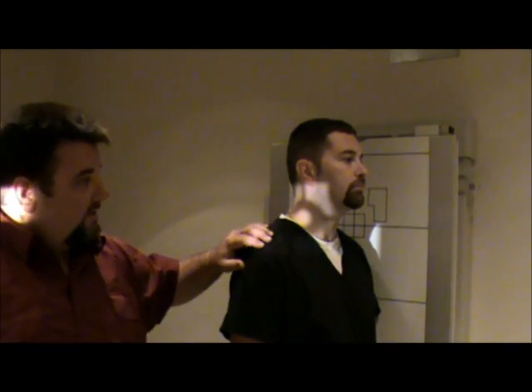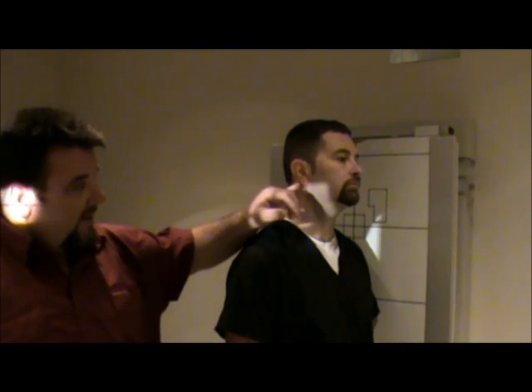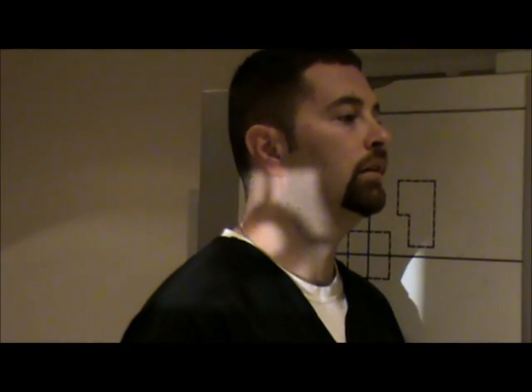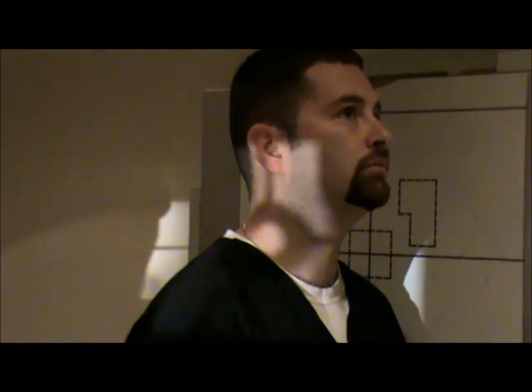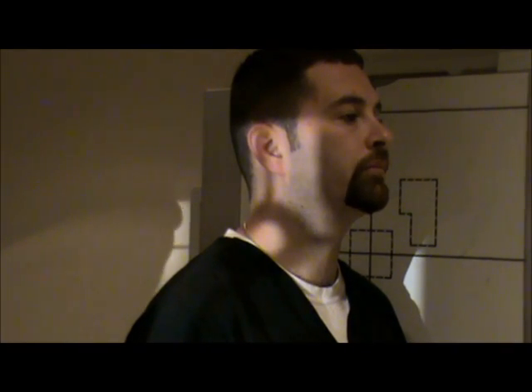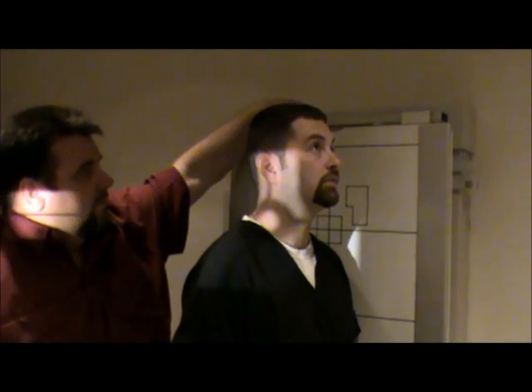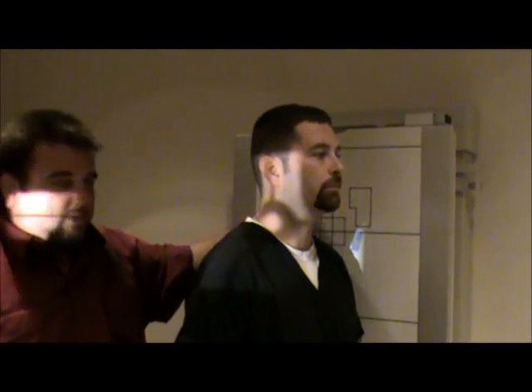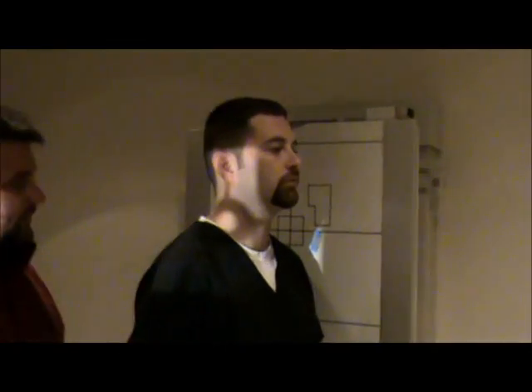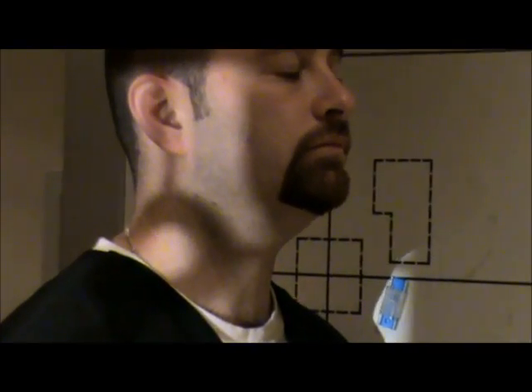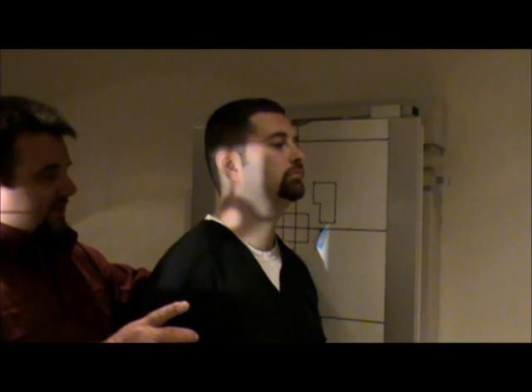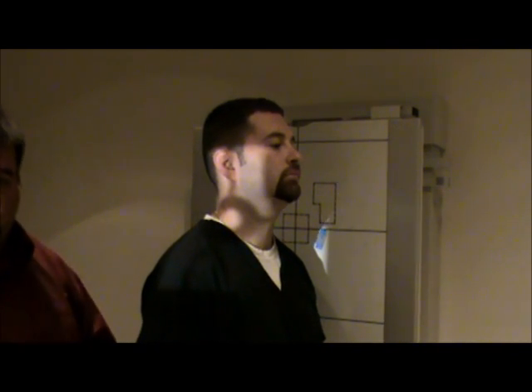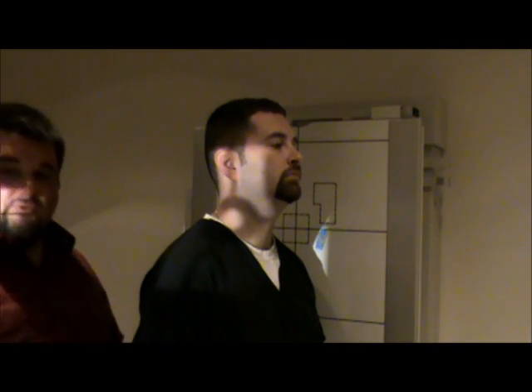We're going to center so that the center comes down right behind the ear at the level of the mastoid. We're going to collimate to the IR borders up and down, and to the skin margins side to side. The marker goes in the light field but will not be obstructing. We want the patient to relax the shoulders down as much as possible. That is our neutral view, same as we do for a lateral cervical.